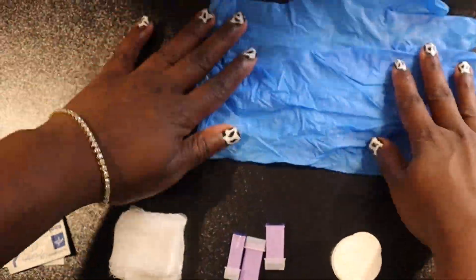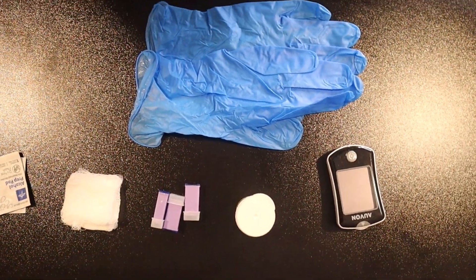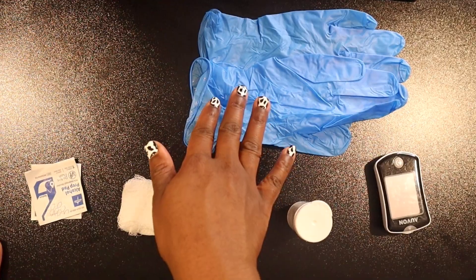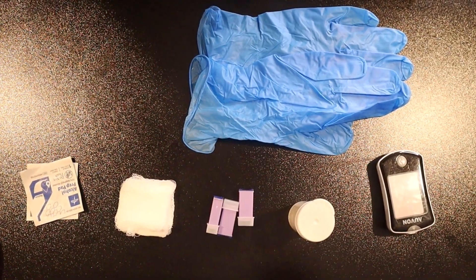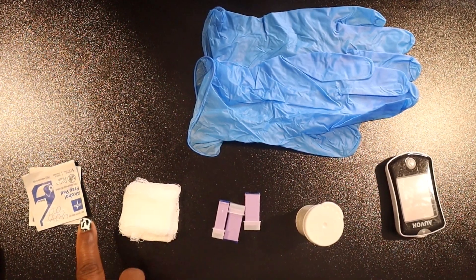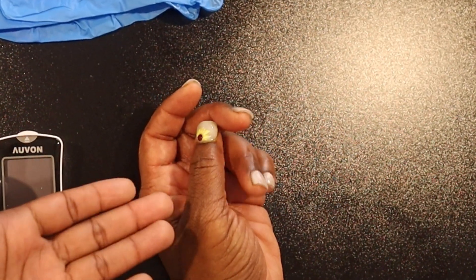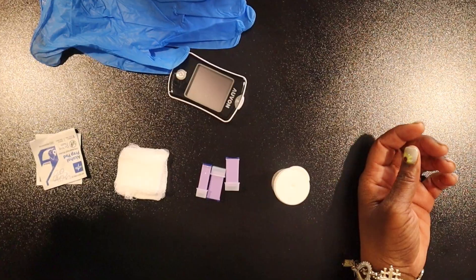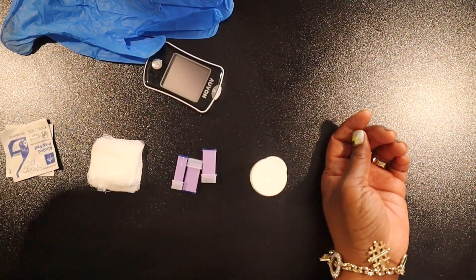We have all of our supplies set and ready to go: our gloves, our glucose meter (also known as a glucometer), our test strips, lancets, gauze, and alcohol pads. I also have my model, who is going to be my mom — she's not diabetic but she has the perfect hand for the demo.